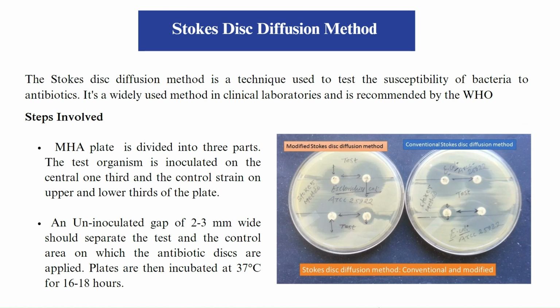Another popular technique is Stokes disk diffusion method. The Stokes disk diffusion method is a technique used to test the susceptibility of bacteria to antibiotics. It's a widely used method in clinical laboratories and is recommended by the World Health Organization.